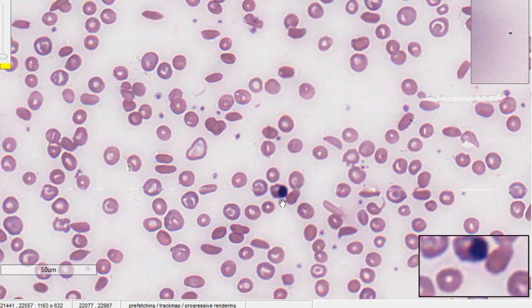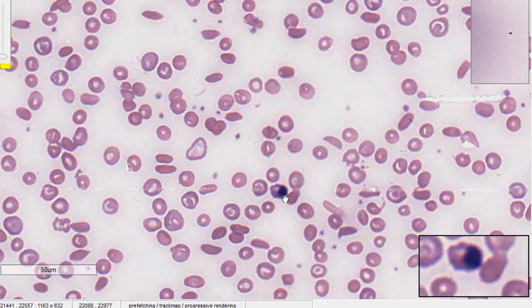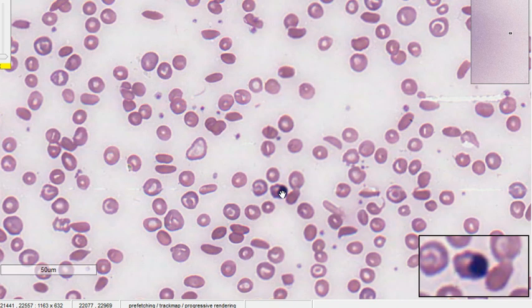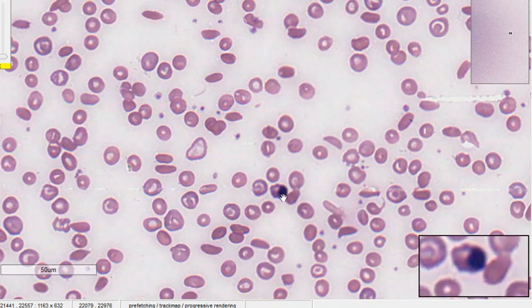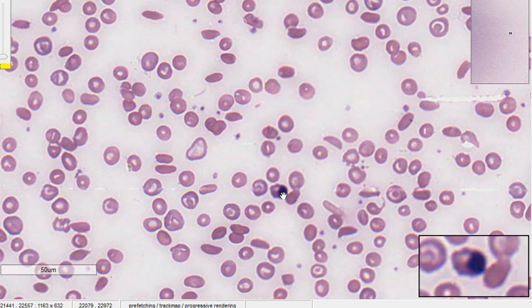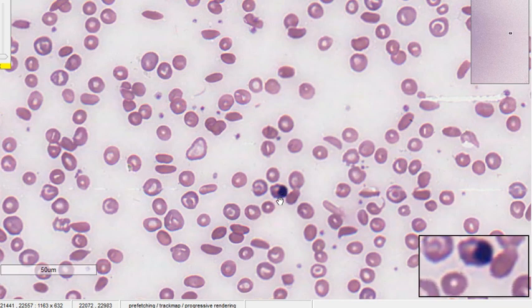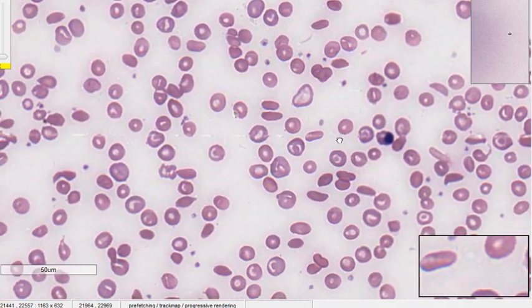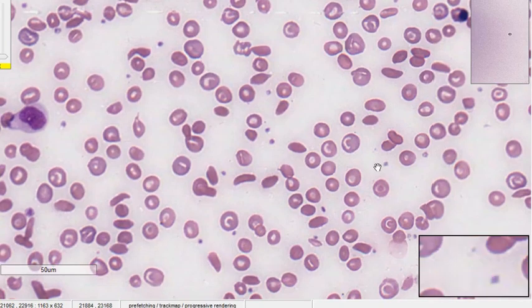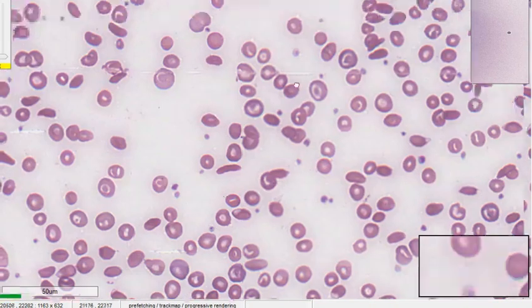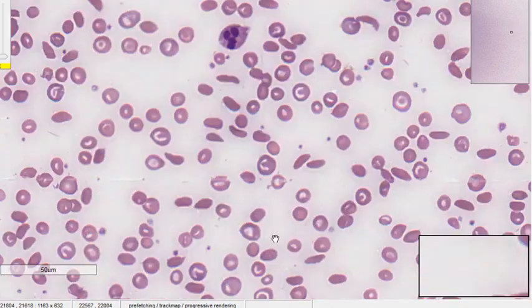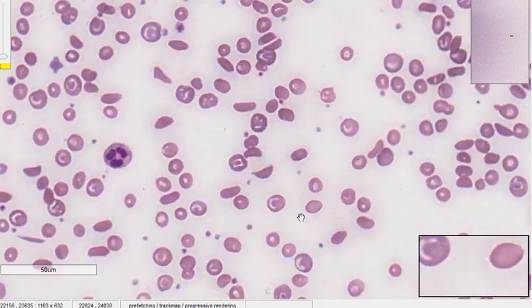This cell here is a normoblast. If you look at the cytoplasm, it has the same color as the surrounding RBCs, confirming it's part of the RBC series — not a lymphocyte, though you might confuse it for one. The nucleus is very condensed, which is characteristic of a normoblast. So this smear has a normoblast in it.